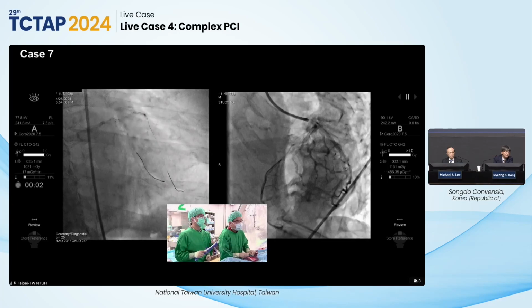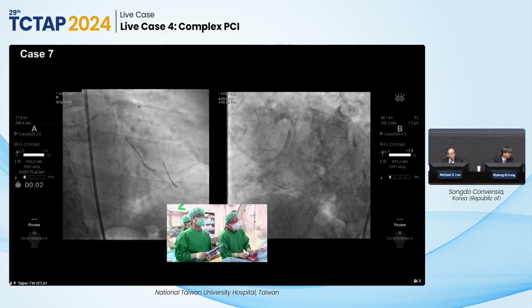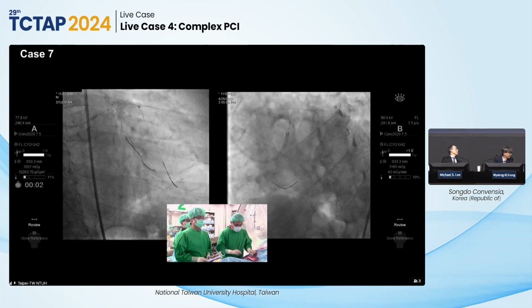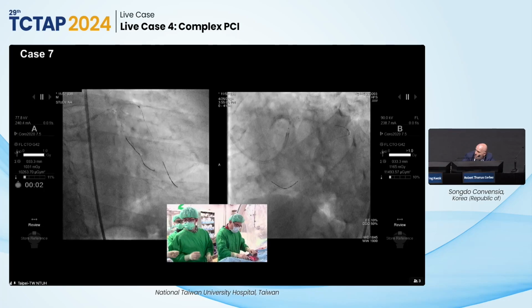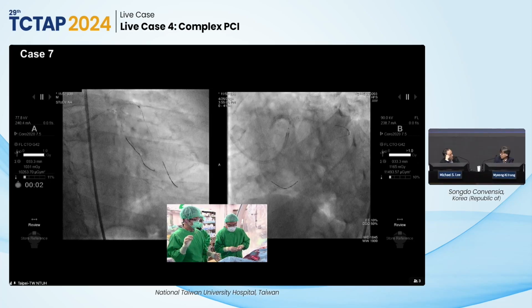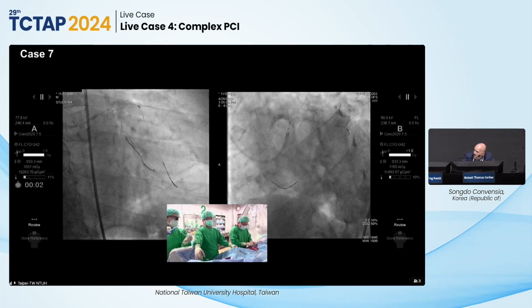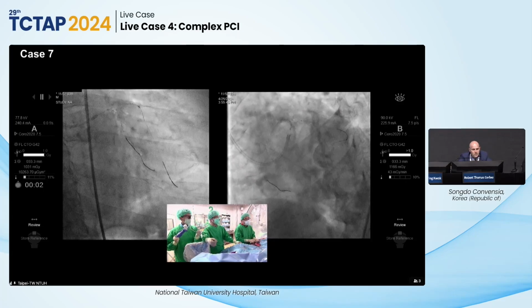May I ask, has anyone on the panel done a KBT with 2 lithotripsy balloons? Okay, another one. Do you know if anyone's put 2? Yeah, it's actually very helpful. And what I've used it in is when the left main is, let's say, a 5 millimeter diameter, 4 millimeters at the largest size. So when you do simultaneous kissing IVLs, you can approximate a 5 millimeter. Yeah, because it would have been a brilliant option here, right? Yeah. But you need 2 generators, I guess. Yeah, you need 2 generators and 2 catheters, so it's very expensive.